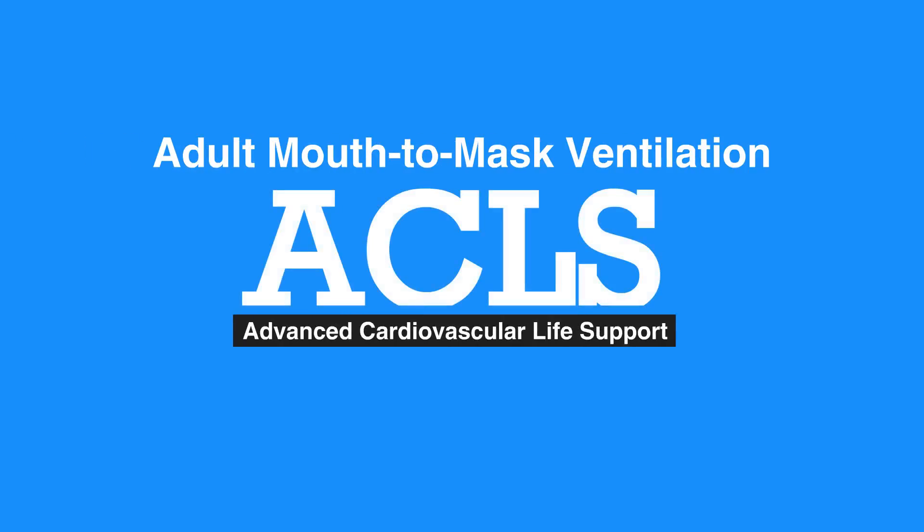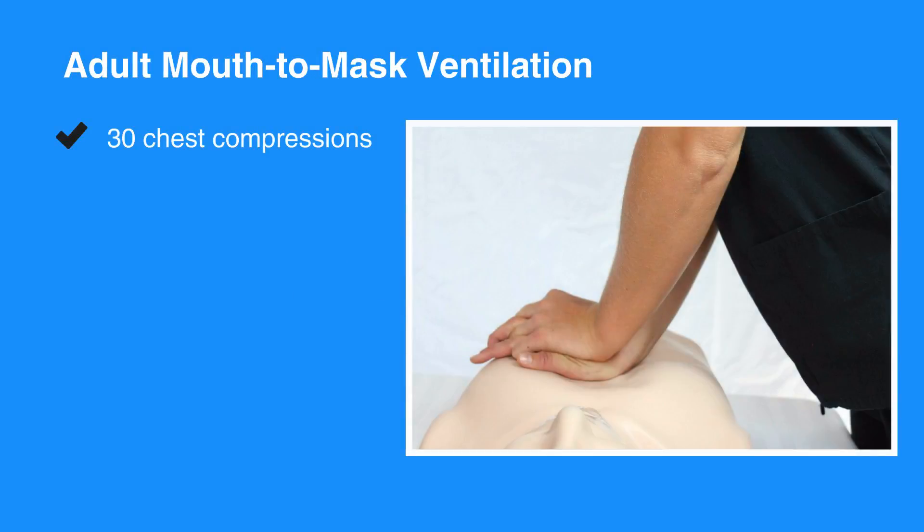Welcome to the adult mouth-to-mask ventilation. In this video, we'll discuss the use of a mask to deliver breaths in one rescuer CPR. Breaths should be supplied using a pocket mask if it's available. First, give 30 high-quality chest compressions.